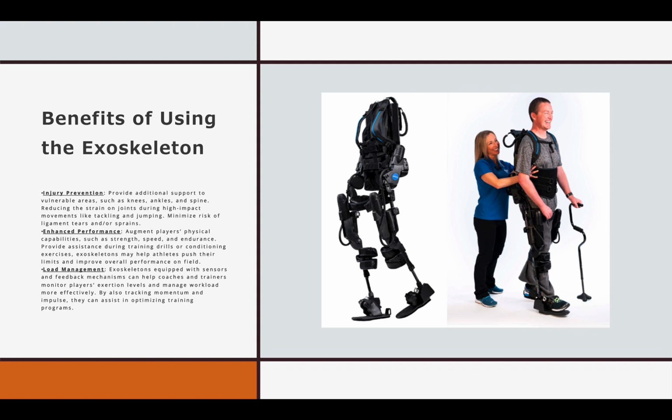And then, of course, we have the load management. The exoskeletons are equipped with sensors and feedback mechanisms that can help coaches and trainers monitor the players' exertion levels and manage workload more effectively. And it also tracks your momentum and impulse, and it can assist in optimizing the training programs.